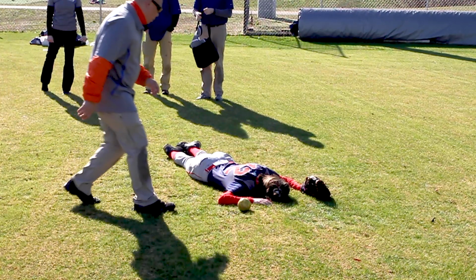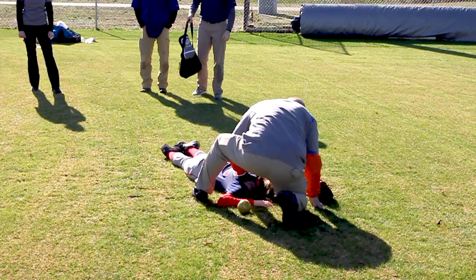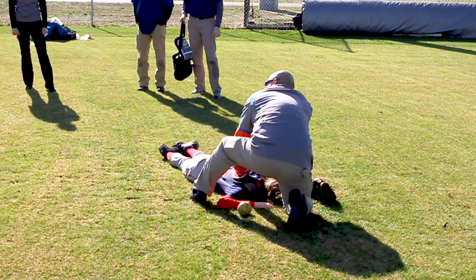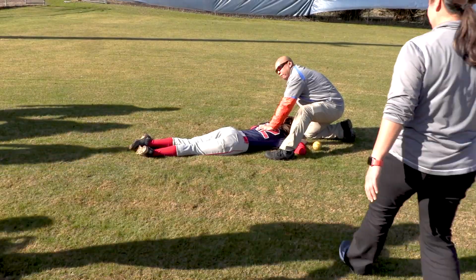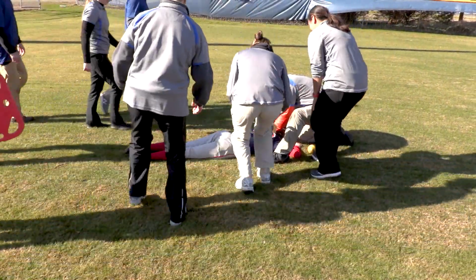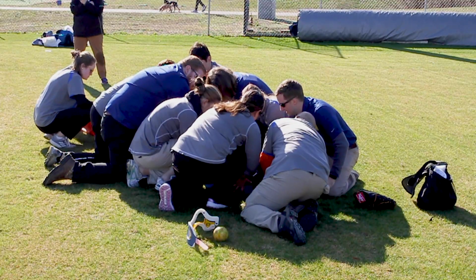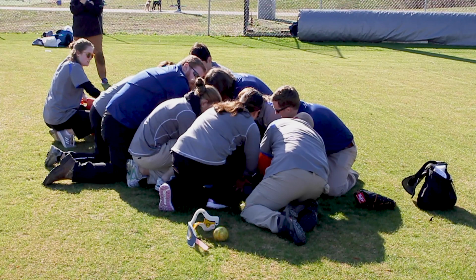If the athlete is prone, the athlete should be rolled supine. The lead must again cross the arms while restricting movement in the neck and head so that when the athlete is rolled, the hands are able to support. The athlete's arms are moved to their side to assist with the roll. Here, the athlete is rolling to the lead's left because the athlete's face is already turned in that direction.